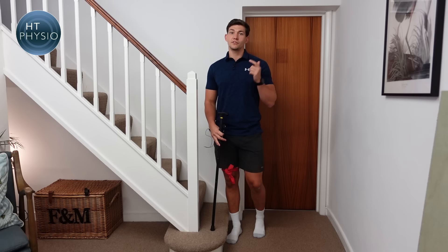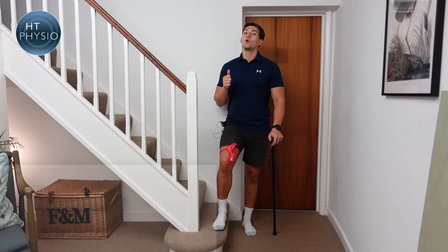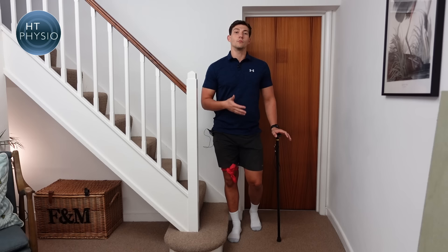If you're wondering what this red band around my leg is, I'm going to use it to indicate which leg is the weaker or injured leg. Most people use a stick because they have at least one leg which isn't quite as good as the other, so that's what this is going to indicate and it will help me to explain.